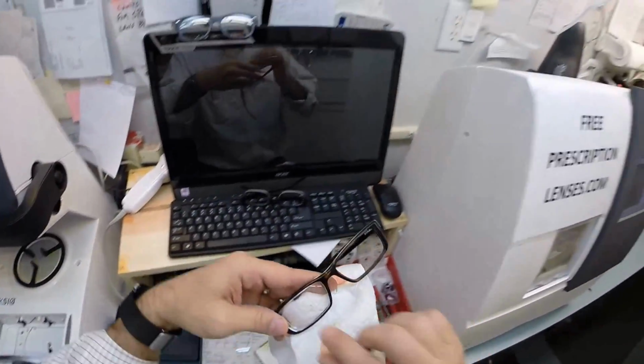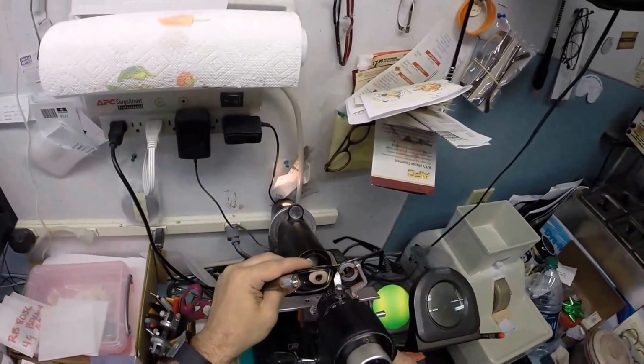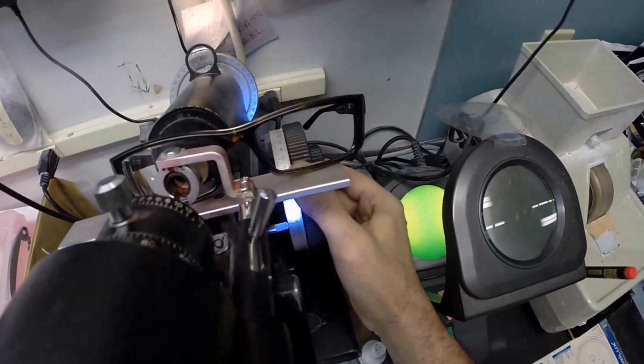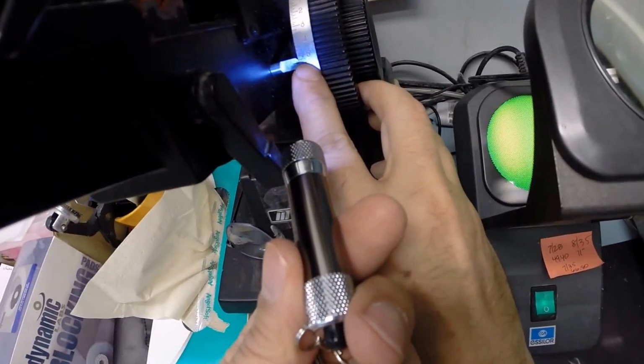Dry the lens off, leaving those dots on there. Now I'm going to inspect the lens. I'm going to spin the axis wheel back to 82, which is the axis for the right eye, and put the lens in just above that dot, which is the optical center, which is the thinnest part of the lens, which is going to sit directly in front of your pupil. I check and I am getting minus 375. Check your astigmatism correction, and we're getting a combined value of 5 1/4. Hopefully you can see that.